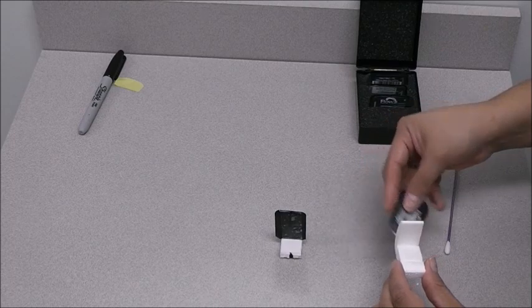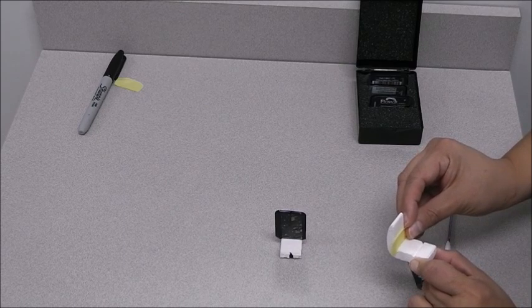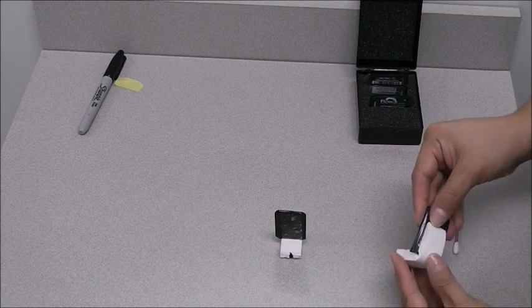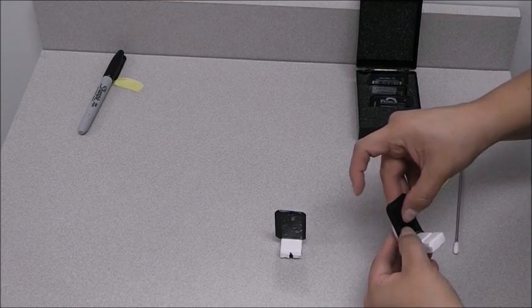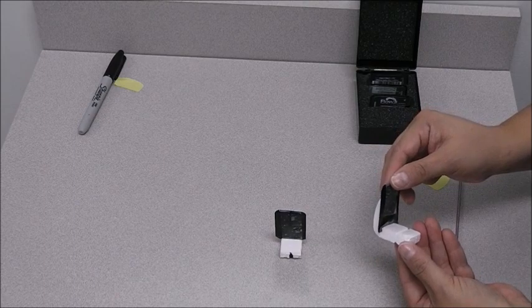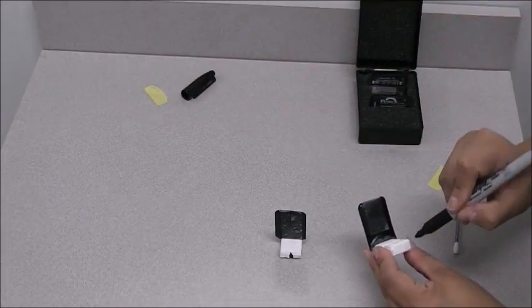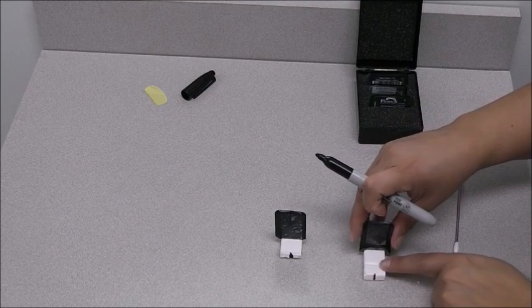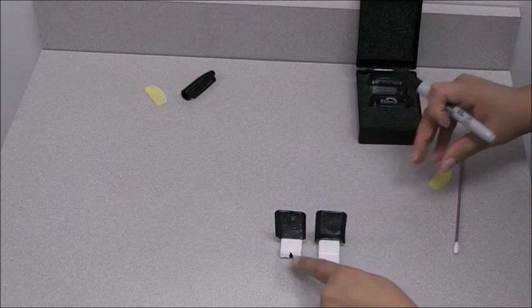Now we're going to place the 'A' into the slot. The bite block has a slot where you're going to place your plate with the 'A' in the slot, so the 'A' is down in the slot. Make sure the plate is in the center of the bite block, then place a piece of tape to keep it in place. Mark your bite block in the center — this is your guide, the middle of your plate. Depending on the patient's occlusion, you can leave the bite block in one piece or break it off.